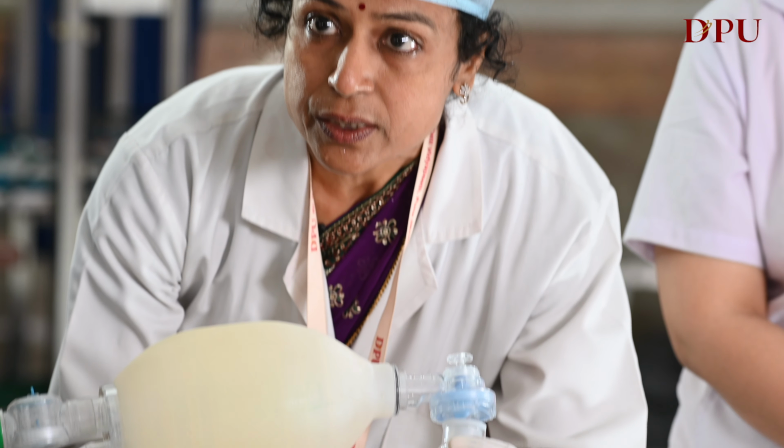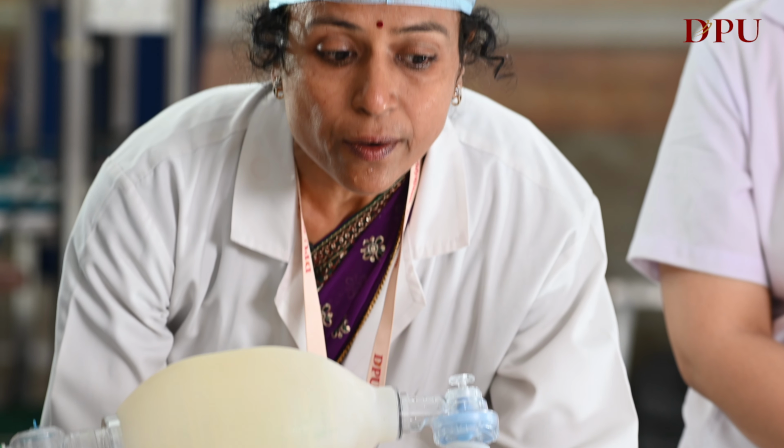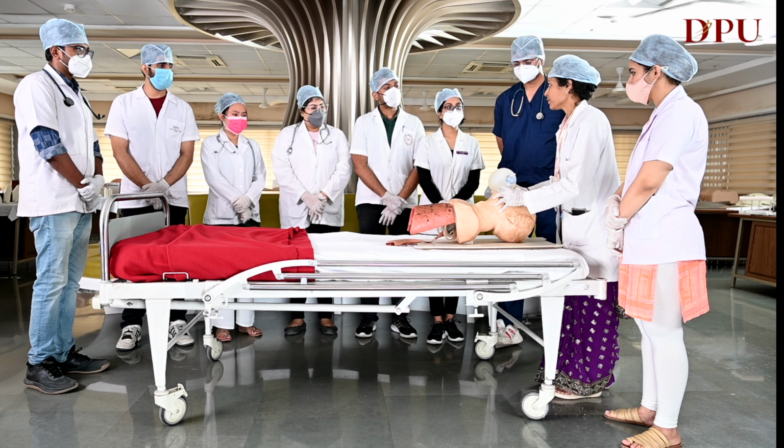I want each and every one of you to do this, because unless you do it, in clinical practice you are not going to achieve success. What you have to look for is the visible chest rise. Here in the mannequin we have kept lungs. By seeing the lungs inflated, you can make sure that your ventilation is successful. So this achieves your 1-person or single rescuer ventilation.